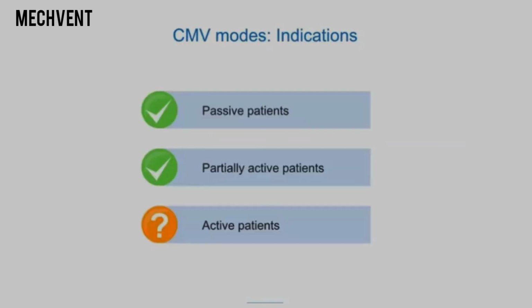CMV modes are widely used. They are indicated for both passive patients and partially active patients. It is possible, but not optimal choice for active patients because patient ventilator asynchrony may occur.